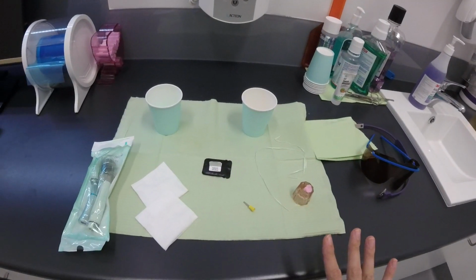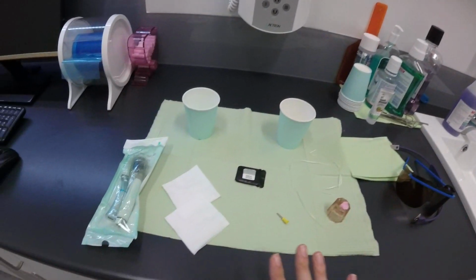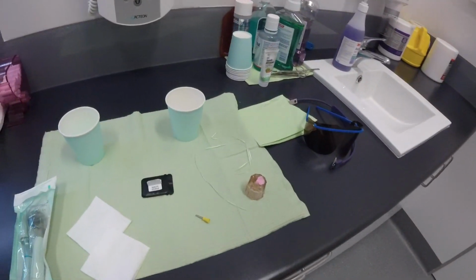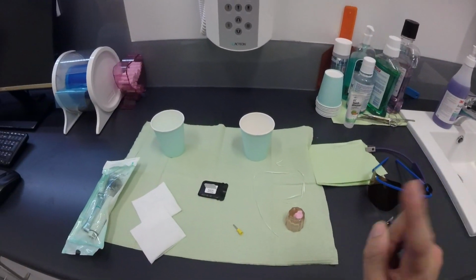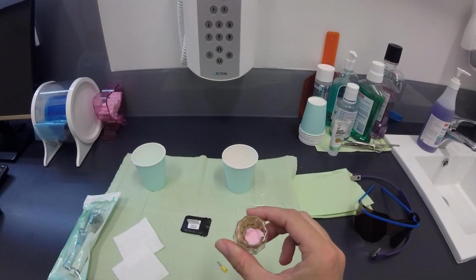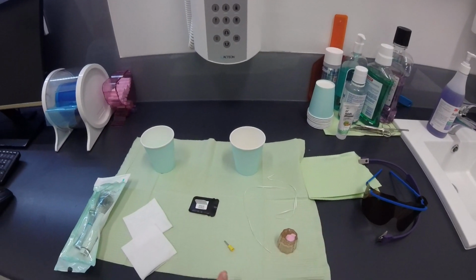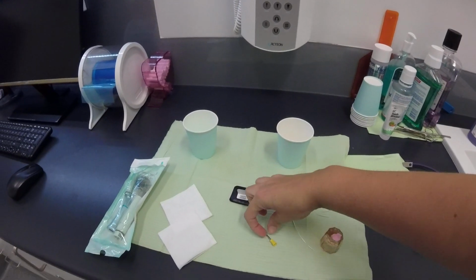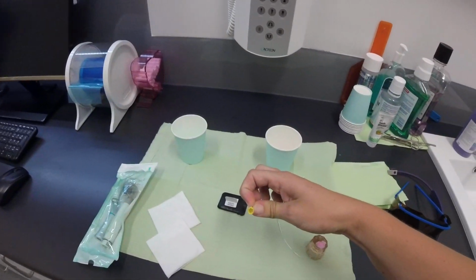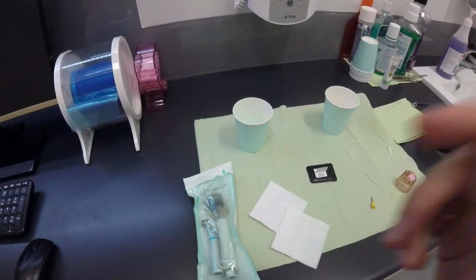First up, when we set up for a check and clean, this is what's on the dental assistant side. This is at my practice. It may be different at yours, but let's have a look. So we've got some Prophy paste here. This is what's used to polish up the teeth. We also have out a Prophy wheel. That's the little head here, and this clips on to what's called a slow speed handpiece, which is over here.